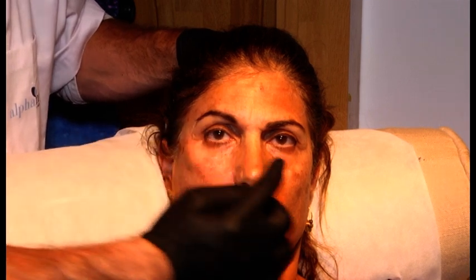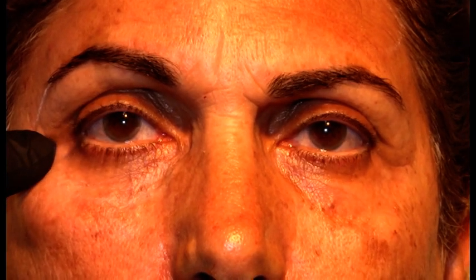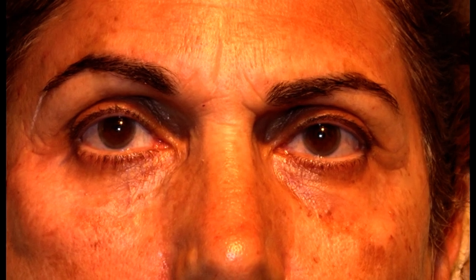So just one last thing I would like to point your attention to. If you inject the palpebromalar groove, and just ignore the bruise that is coming here, okay? But look at the position of the lateral canthus and compare it to the position of this lateral canthus. You see that there is an improvement in the tilt, the canthus has been pushed up. Do you see the difference?